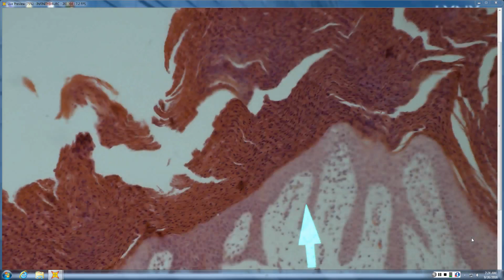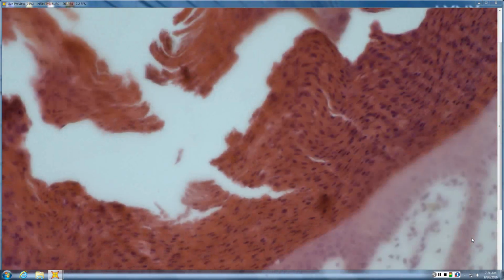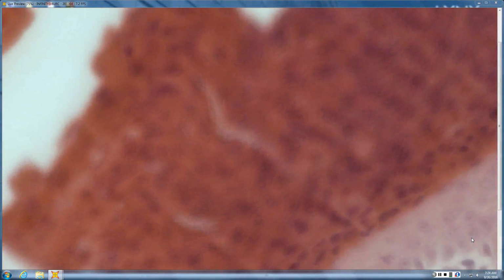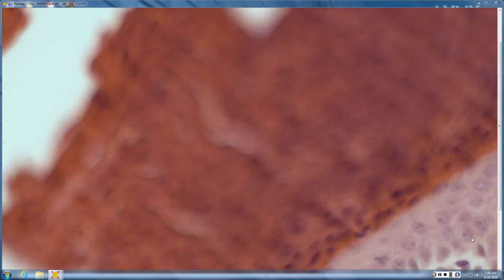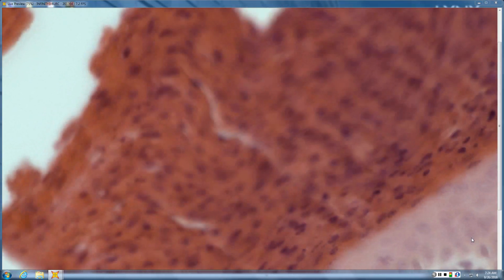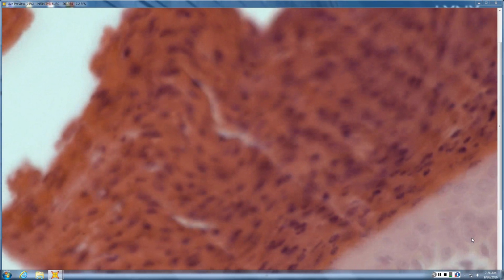And so if we get really, really close, which again, this isn't a perfect cut, but when you get this on a test, sorry, I know that was horrible. Well, it's hard to see on this one, but in here there are still granules. So there's granules in the stratum corneum that only occurs in granular parakeratosis, and then maybe you get some retention of the granular layer there. Just use your dermpath imagination goggles on that one.